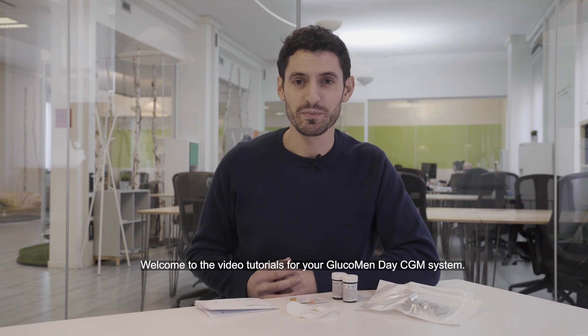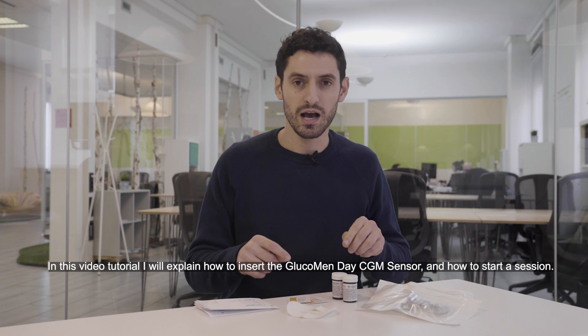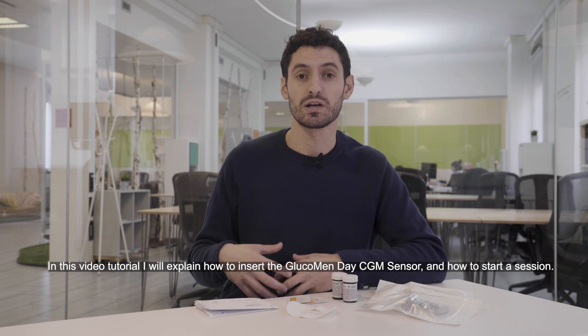Welcome to the video tutorials for your GlucoMen Day CGM system. In this video tutorial, I will explain how to insert the GlucoMen Day CGM sensor and how to start a session.